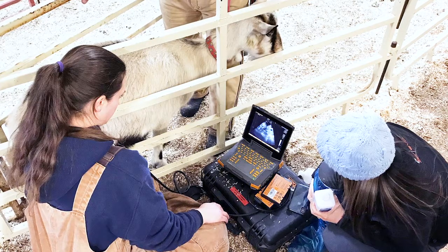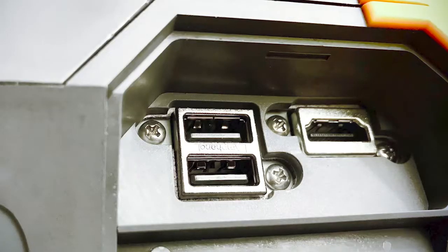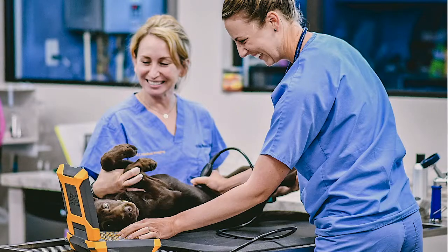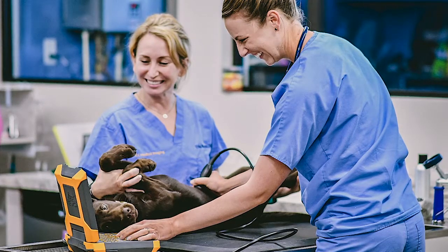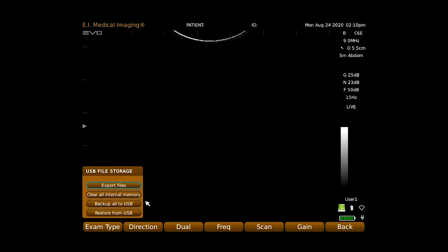No other system on the market today has the versatility and durability of the Evo for a mixed practice. The Evo has two USB ports for exporting images in either standard JPEG and AVI or DICOM format, so you can view files easily on your computer or send them to a referral specialist in their preferred format. A thumb drive is also used for performing system backups and software upgrades.